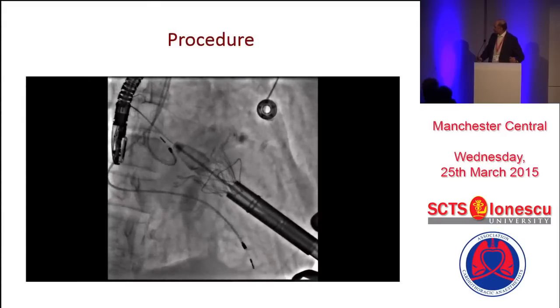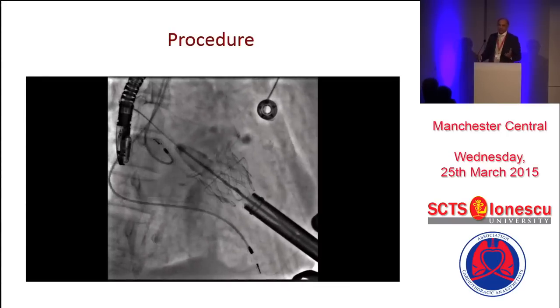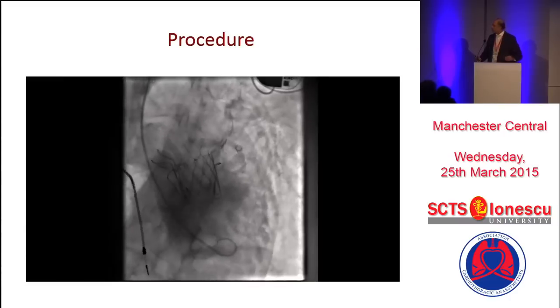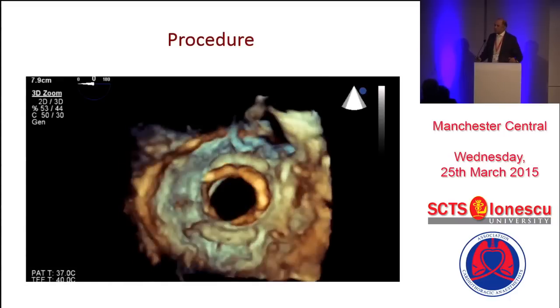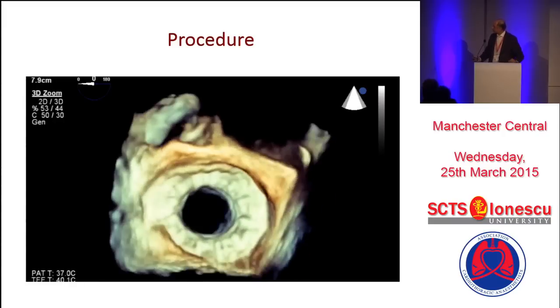The valve is released, and if you have caught the A2 and P2 properly, this is a really good procedure. We have already discussed that a tethered P2 is going to be a challenge. But you can get some beautiful images.